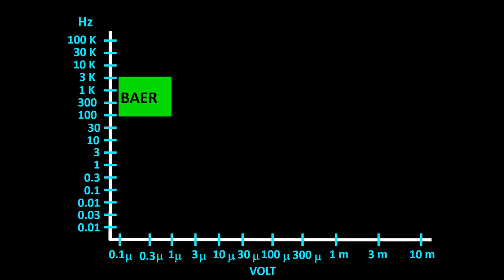In this new frame, I have used the same figure that I used in the past to represent filters. As you can see, the amplitude for brain auditory evoked responses collected from the ear is a low amplitude enterprise.